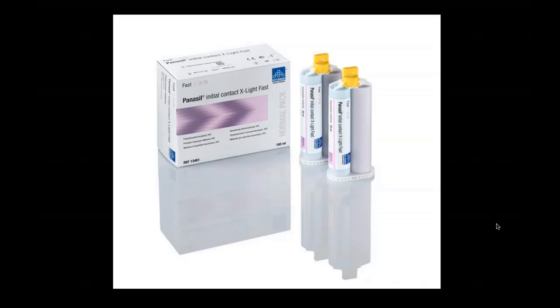I have a couple of questions here. What do you recommend for sleep appliance TMJ impressions? The same thing we just talked about. You can use the Silginat on the top. I have made a number of sleep appliances, and I send it right to the lab. And then I would do the putty wash, the wash being the Panasil extra light fast on the bottom. It works wonderfully.